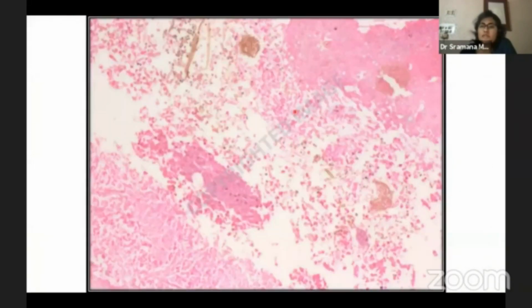So this was also another case where there was a fungal ball, but can you all pick up that there is a little bit of pigmented spores and a pigmented fruiting body? So having said that Aspergillus is a hyaline fungi, certain species like Aspergillus niger can produce pigmented colonies, and we can see this pigmentation. So a pathologist can think about an Aspergillus niger species also on the biopsy specimen, but that definitely needs a culture confirmation and correlation.